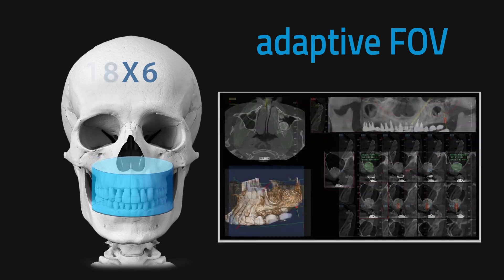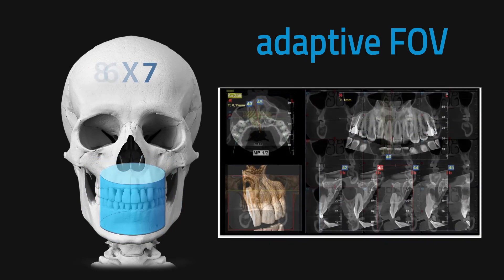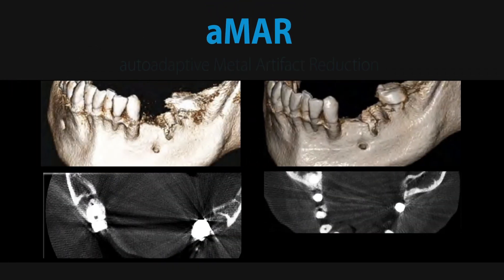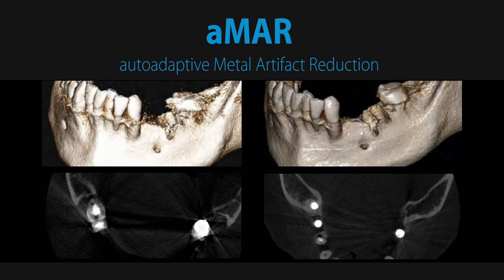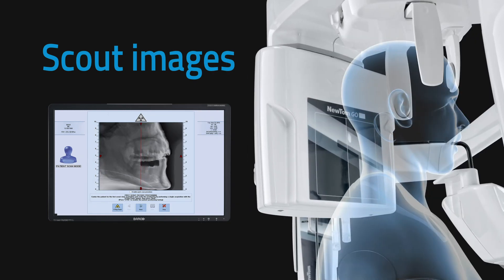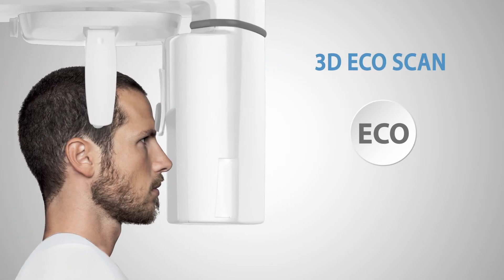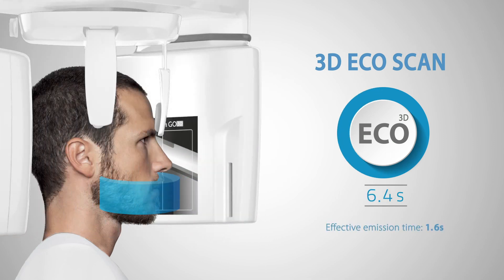NewTom Go generates outstanding volumetric images for each FOV, ranging from 6x6 to 10x10 cm. An intelligent software function automatically reduces interference from metal artifacts to a minimum. Perfect positioning is achieved by acquiring two scout images before the 3D scan. 3D pulsed emission scans lasting 6.4 seconds using CBCT technology reduce emission time to just 1.6 seconds with a 3D EcoScan protocol.